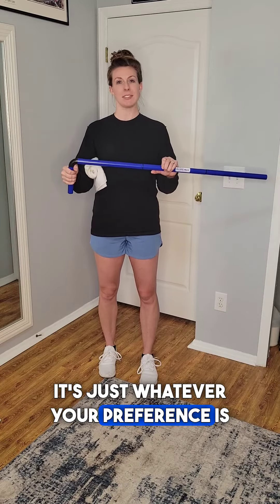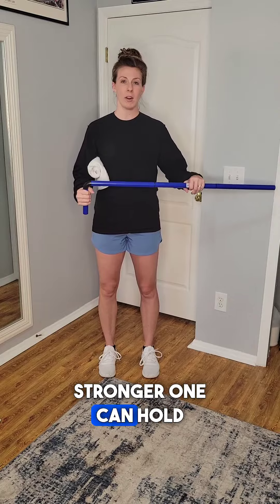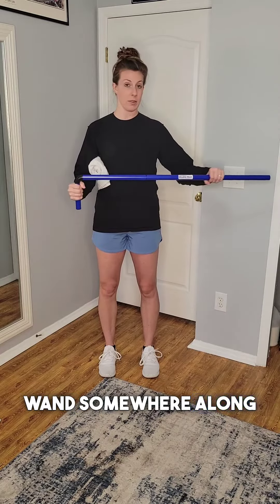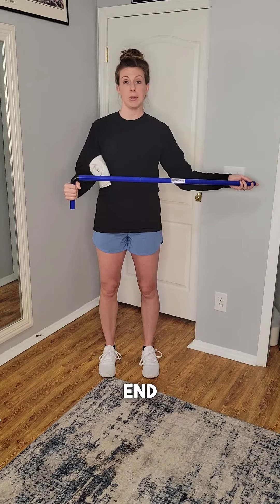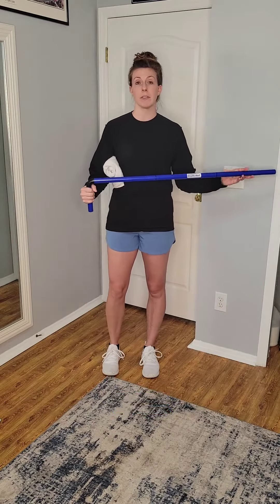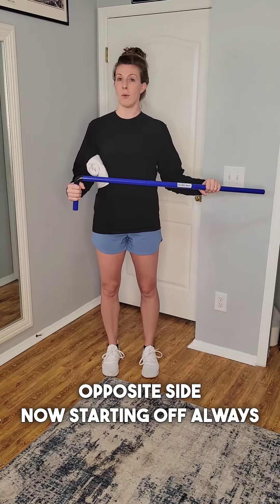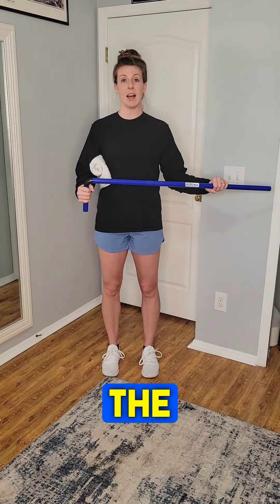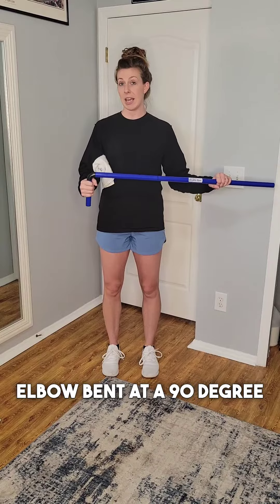It's just whatever your preference is. Your opposite side, which is the stronger one, can hold the wand somewhere along the body of the wand, or it can hold on the end — totally up to you. It's just whatever feels comfortable, because that side is the one that's going to assist the opposite side. Starting off, always good upright posture, and that side that's getting the help is going to start with the elbow bent at a 90 degree angle.